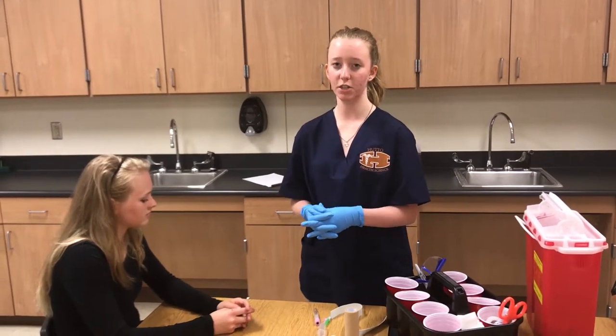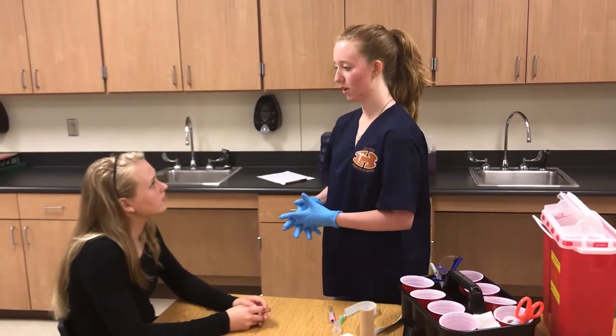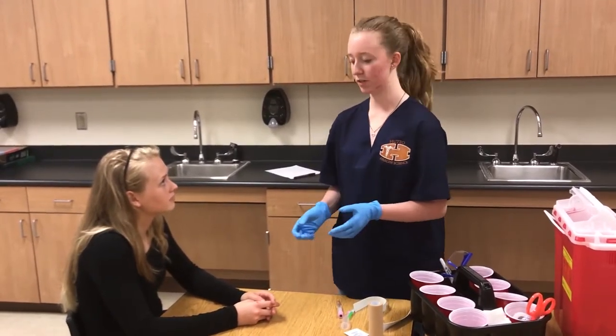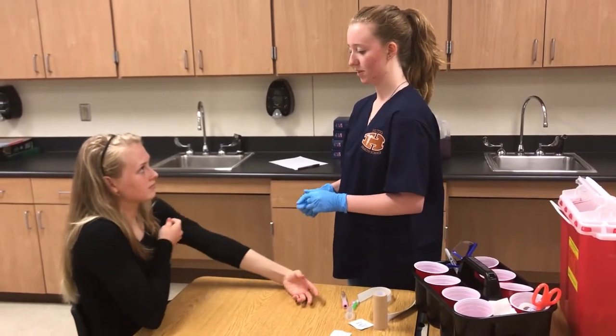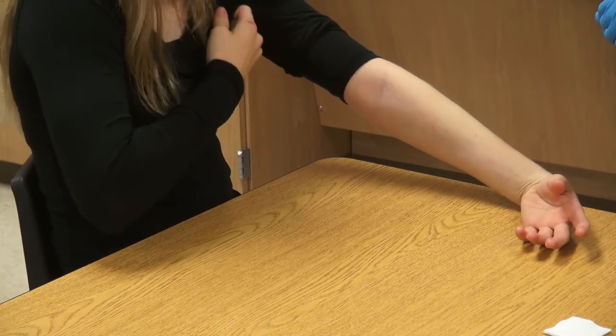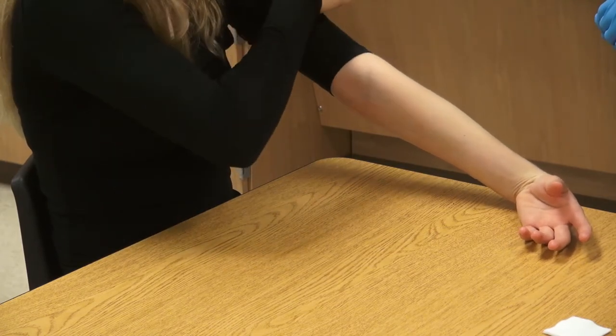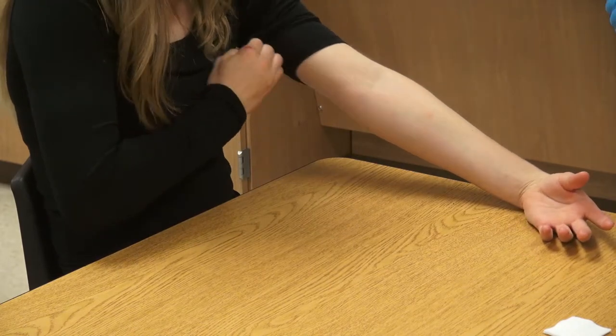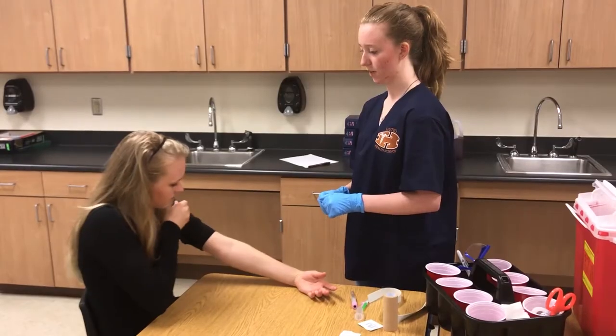First, ask the patient if she has a preferred arm. 'Do you have a preferred arm?' 'My left one.' Then tell the patient to roll up their sleeve or do it for them. 'Could you roll up your sleeve, please?' The patient rolls up their sleeve. 'A little bit more, please. Thank you.'